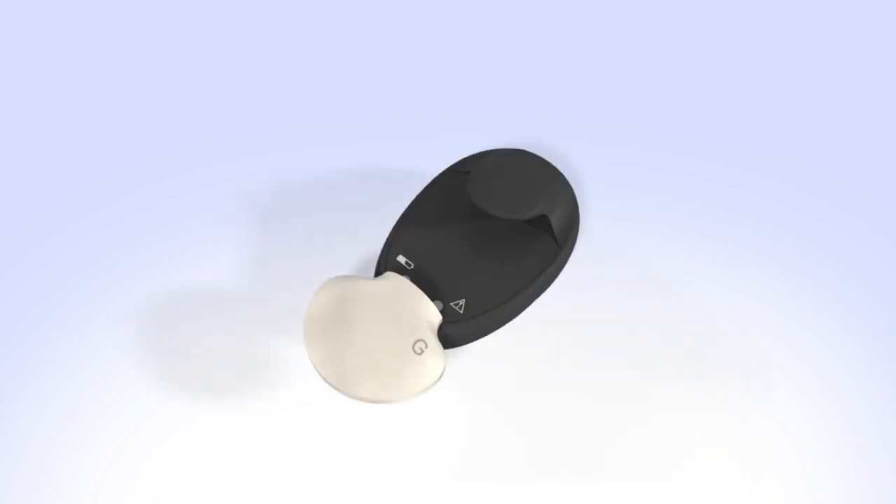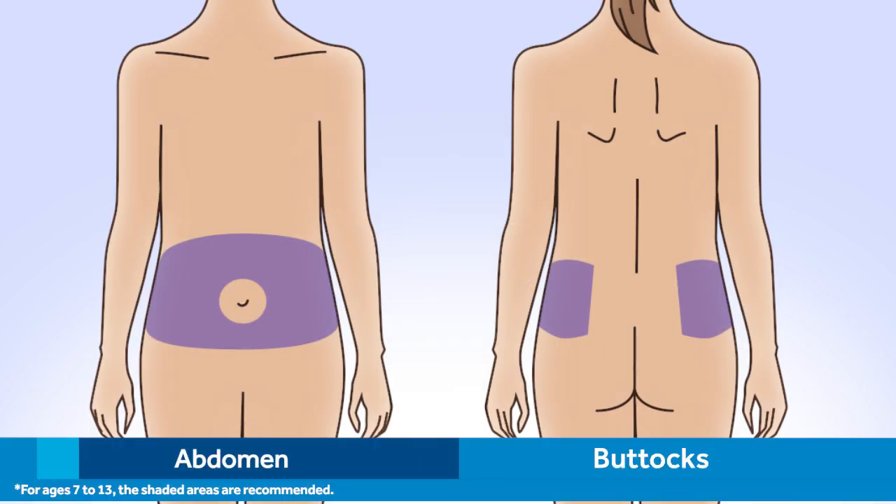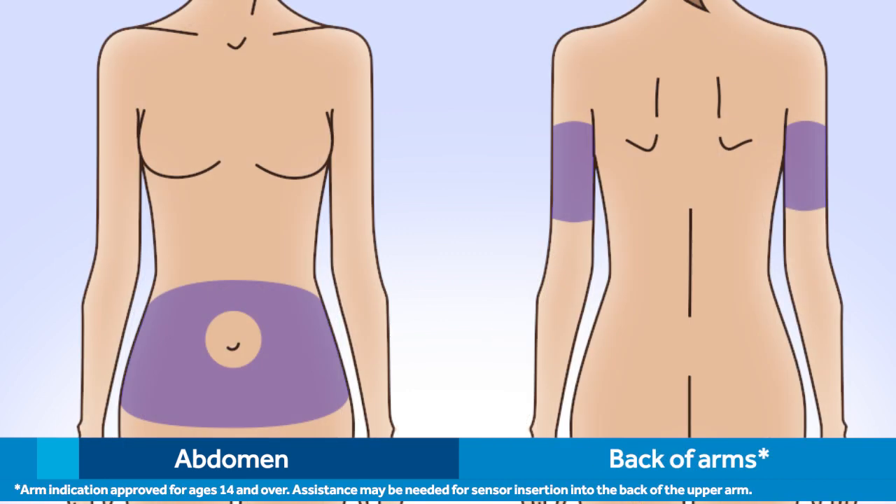Be sure to follow the instructions in the user guide on how to properly clean the transmitter. Then place the transmitter back in the charger so it can be recharged. Next, you'll need to choose a site to insert the sensor. For ages 7 to 13, the shaded areas on the abdomen and buttocks are recommended for insertion. For ages 14 and above, the shaded areas on the abdomen and the back of the upper arms are recommended for insertion.